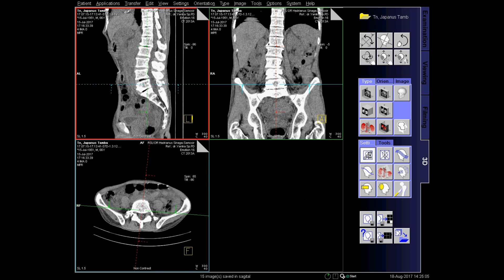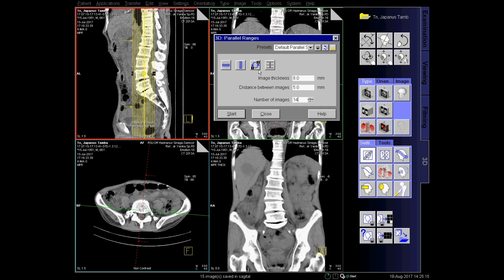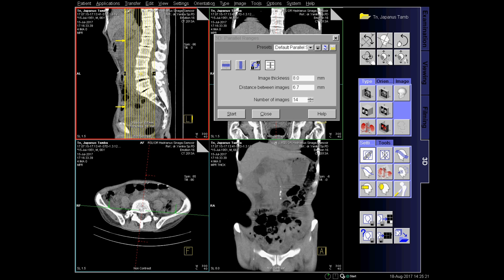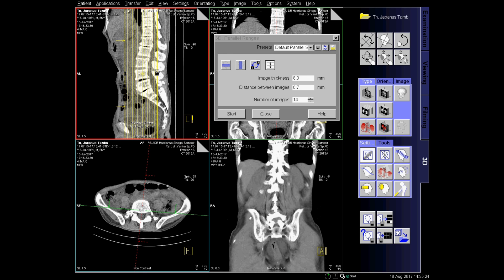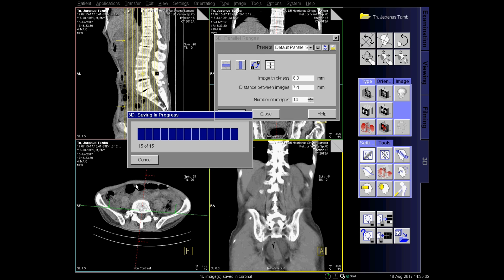Now we continue by making coronal image pieces. Again we set the parallel range with image thickness equals 8mm and number of images equals 14. Then we set the left border and the right border of the image cutout which we want to enter later in the filming menu. Start so that the cutout data matches the parameters we have set, then save and name it coronal set.